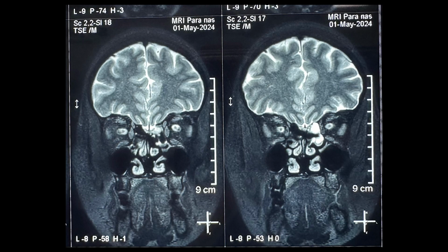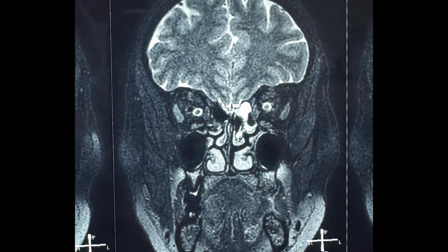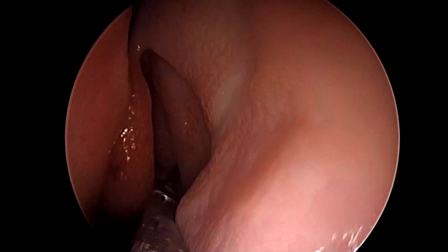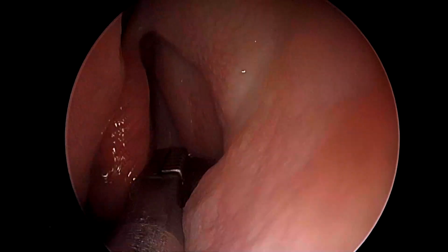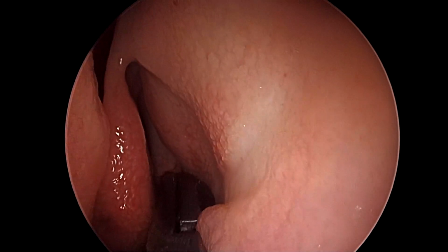This is the MR imaging of a middle-aged female patient displaying a skull-base defect at the fovea ethmoidalis with a protrusion, most likely a meningocele, inside the ethmoid sinuses, the anterior ethmoid. The patient presented with a profuse watery discharge from the left side nasal cavity, which is spontaneous and sudden in onset with no history of trauma.